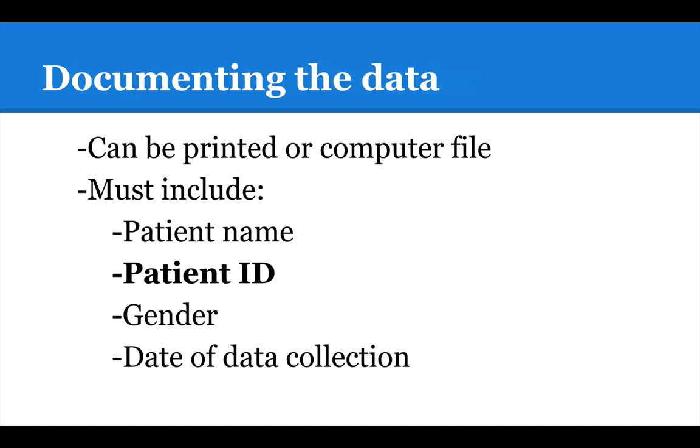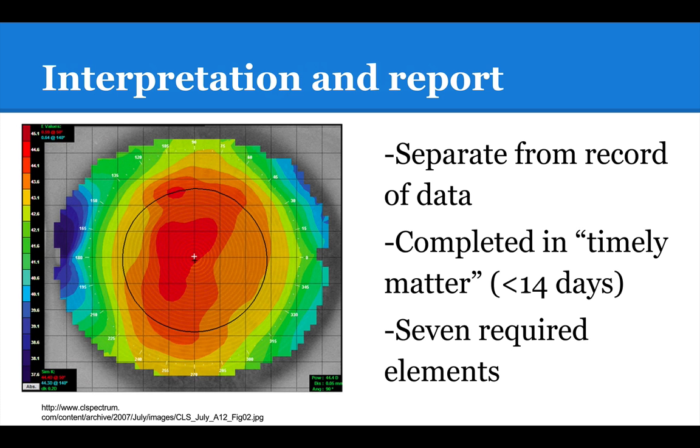The one thing is our patient ID, including that unique identifier from Revolution consistently into all of our equipment as we run testing. That's our main way that we can improve in this information we need to include with the data. So then finally we need to interpret the data and report on it.